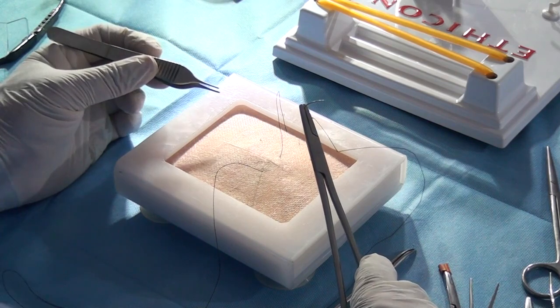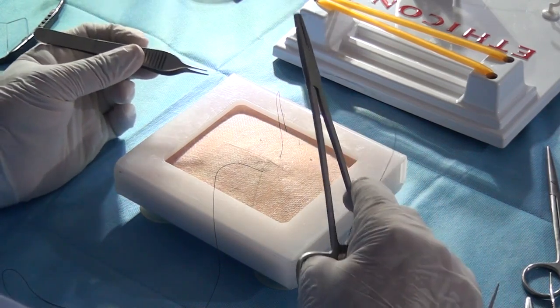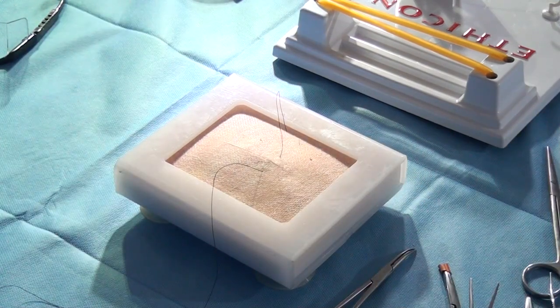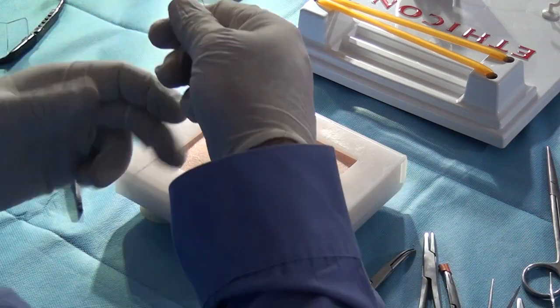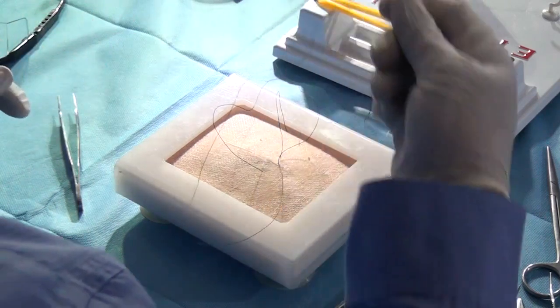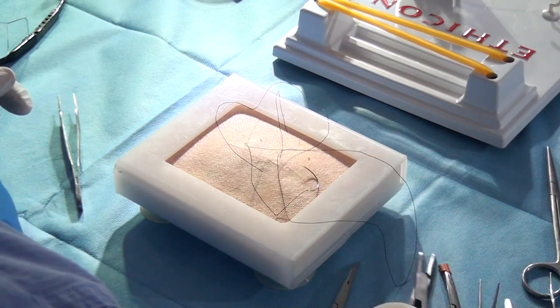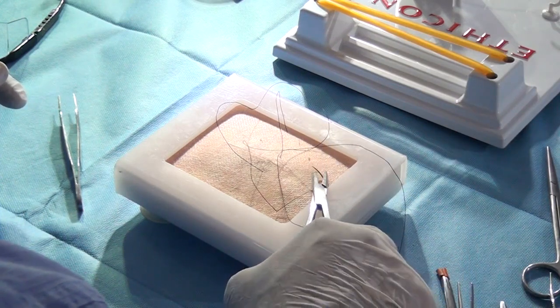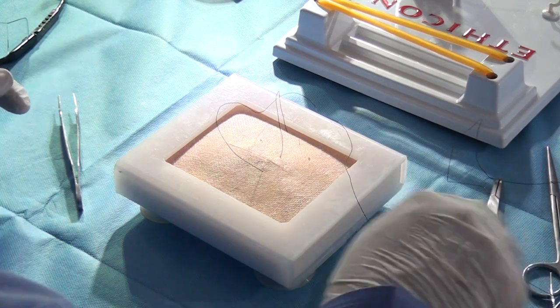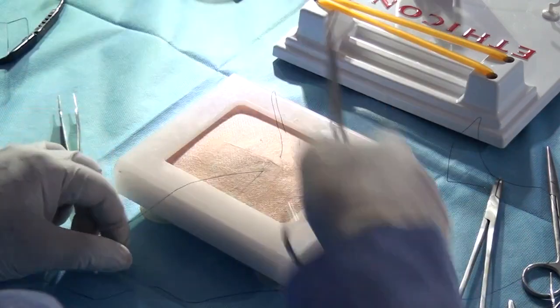Watch here. Sometimes, and it happens all the time, I've taken a bite, I'm showing you the wrong way of doing it, and the needle has gone somewhere. Then you start pulling it out, and it has gone all over the place. This is a ridiculous, wrong way to do it. Why do you keep it on the needle holder? It will not hurt anybody, it will not get into the patient anywhere, and you can leave it on the needle holder and use another instrument or hand to put the knots. We'll do knotting today so you'll know.